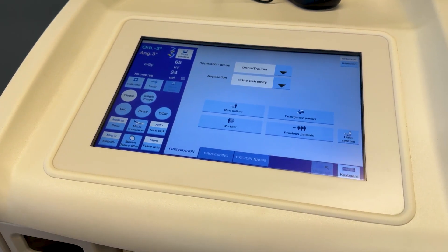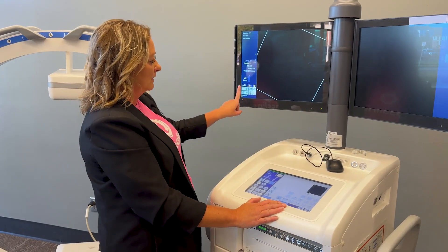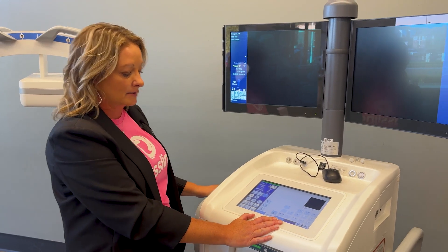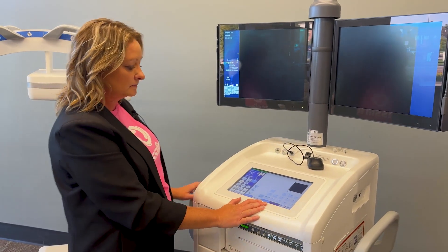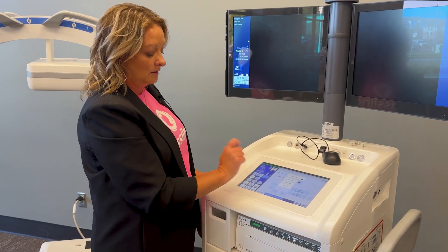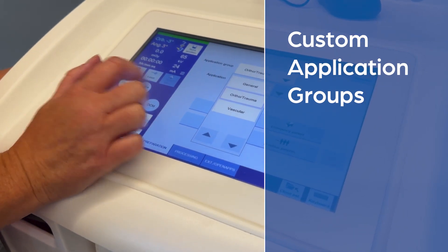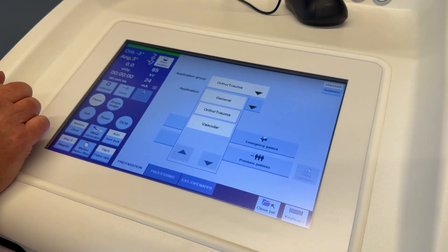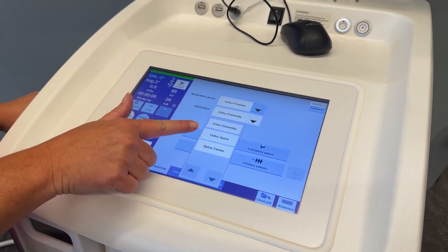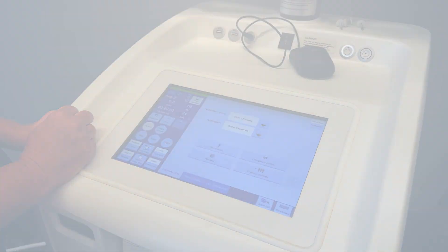The monitor cart has the same touch screen icons as the back of the C-Arm, and then you have icons that you may be familiar with from all of the other Siemens equipment across the Siemens platform. From your preparation screen you can get to specialized application groups that we can customize to your facility, and within those application groups you can choose from ortho extremity, ortho spine, spine center, pediatrics — anything that we can customize to your facility. Thank you.